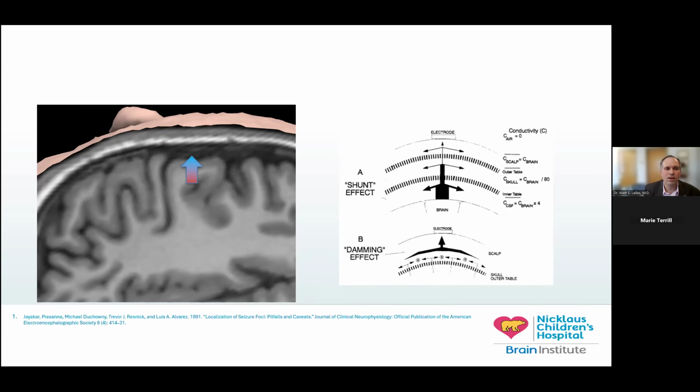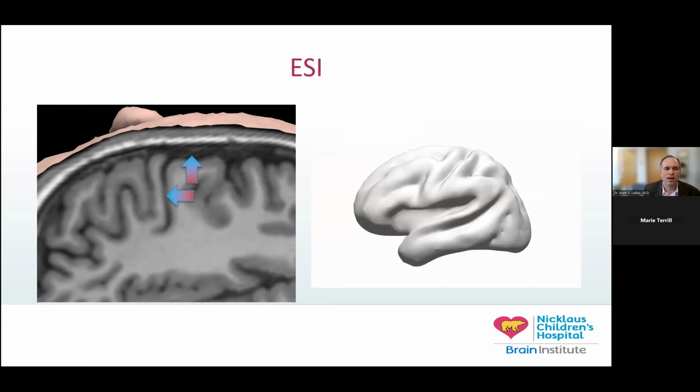The end result is whether we have this outward going current immediately, or whether we have a more horizontal tangential going current, when it's being read, the EEG is essentially looking kind of like this at the brain. The brain is not as highly detailed as we'd like on our standard EEG because it's looking at large scale areas that have had their activities attenuated as well as summed all together.